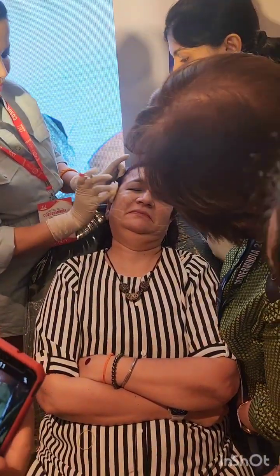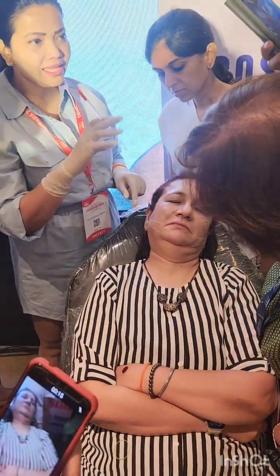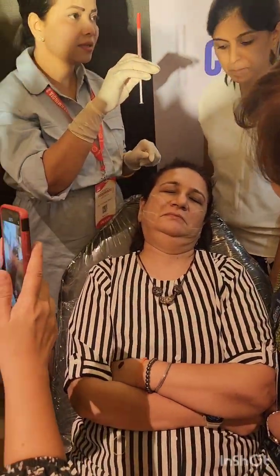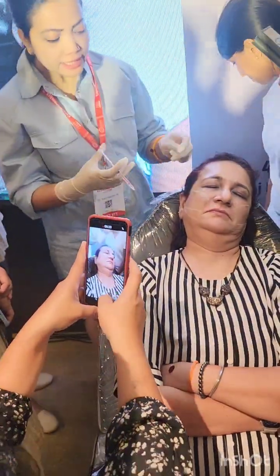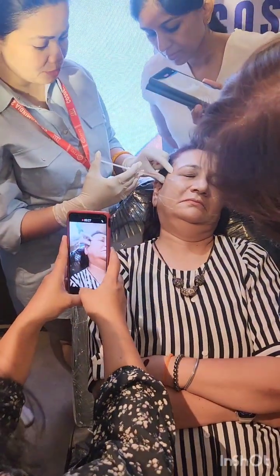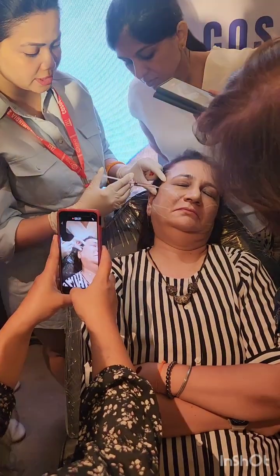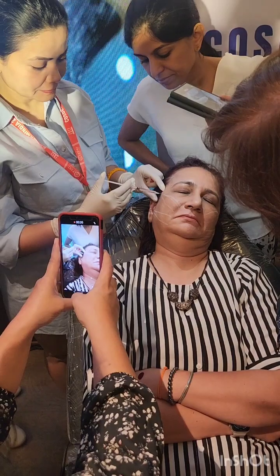So now nobody touches. This is our entry points. These are mixed, these are plain. So how do you anesthetize? First go deep. Ma'am, sorry, there will be one breath. Go deep, give a bolus, then come to scan. You have to follow the path of the needle.